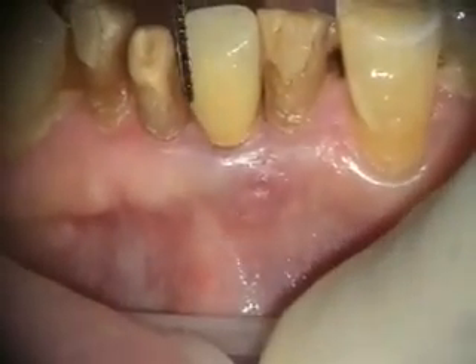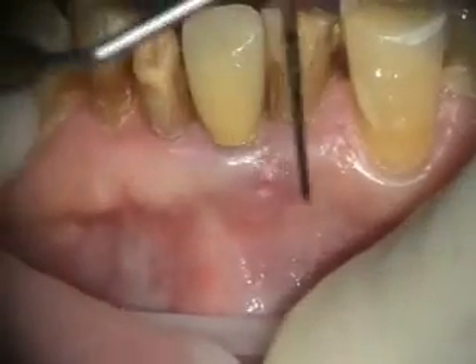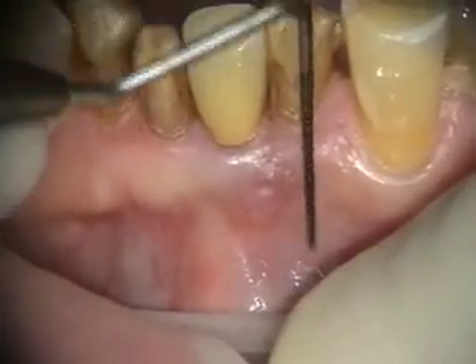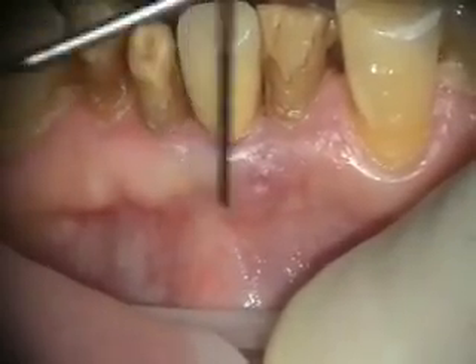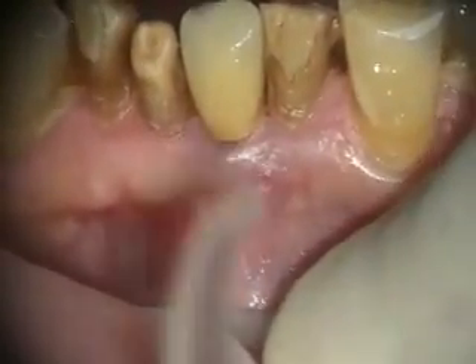This implant is about five years old, so we're going to be making a tab flap here and exposing the implant.